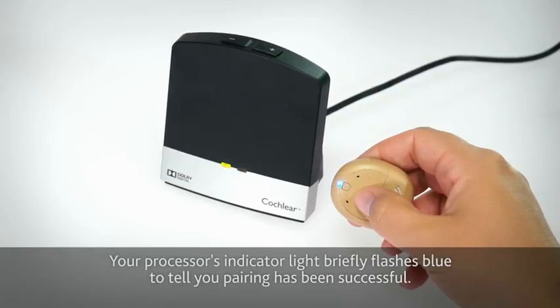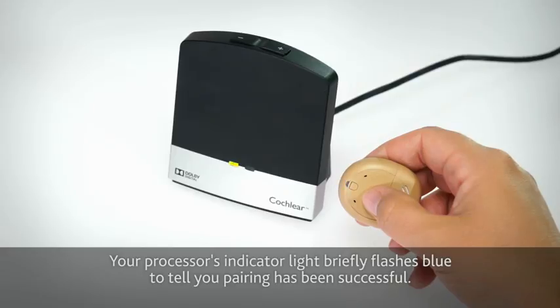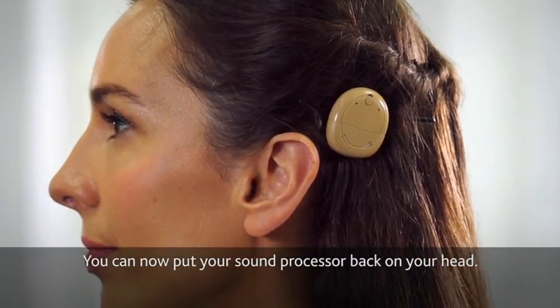Your processor's indicator light briefly flashes blue to tell you pairing has been successful. You can now put your sound processor back on your head. The TV streamer has been paired.